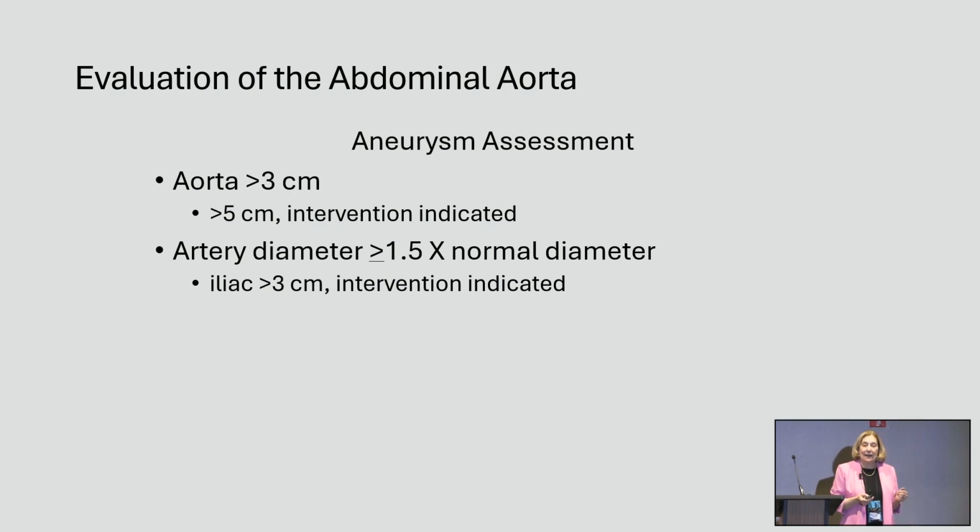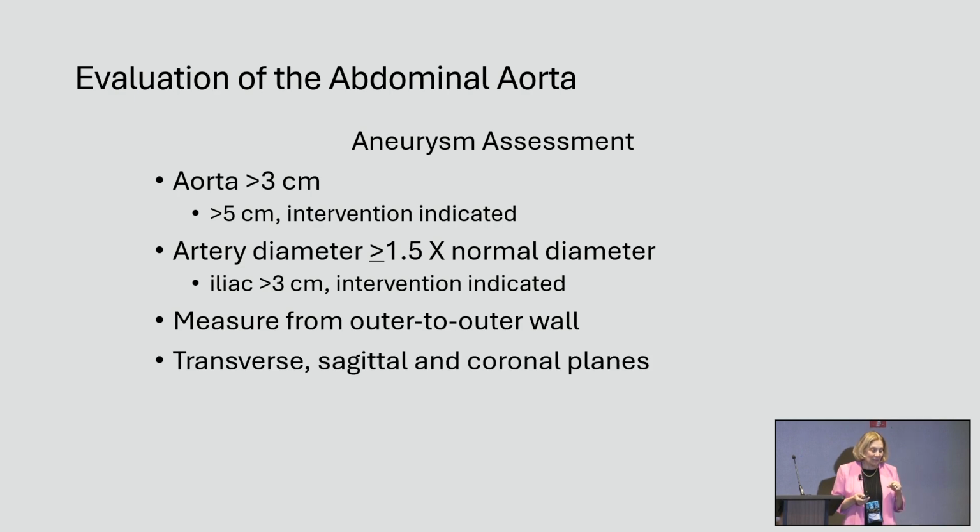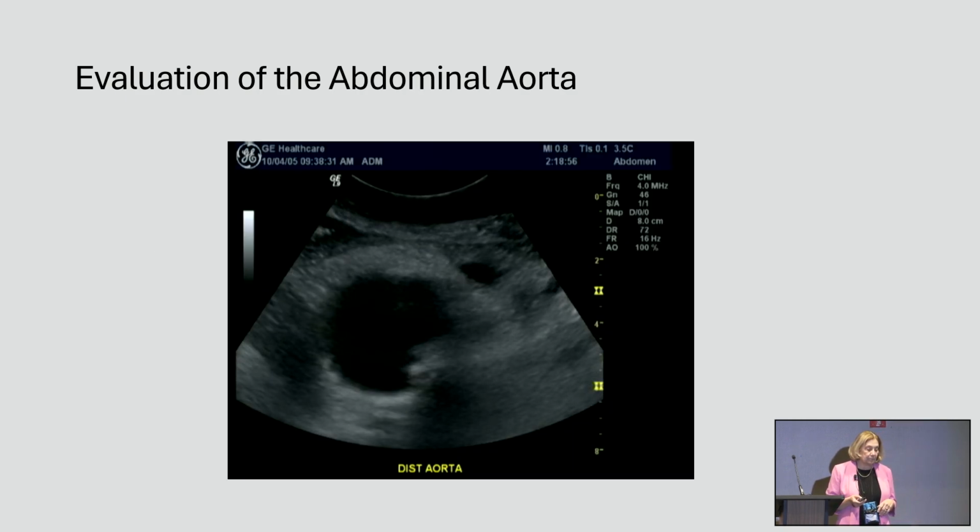I had to ask a lot of people, what would you call too big at that point? It's very important that whatever we think, we measure it outer wall to outer wall and measure it accurately. Where those cursors go matters. Use both the transverse and the sagittal, and don't forget there's a coronal plane that you can use, either coming from the side while the patient's lying, or by turning them on their side. I'll show you some good reasons for that.